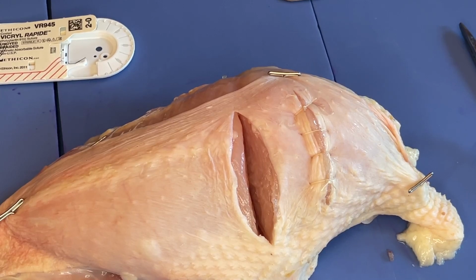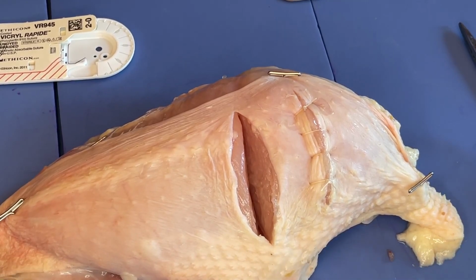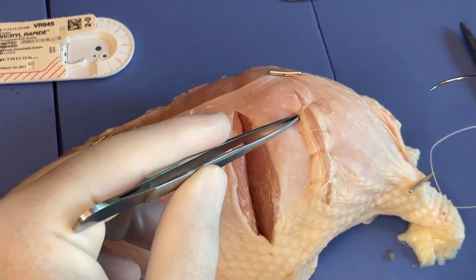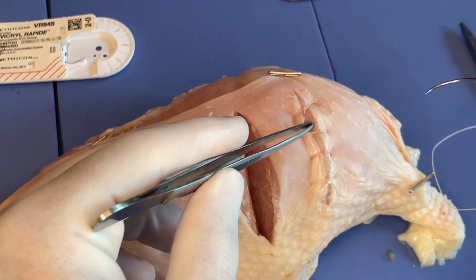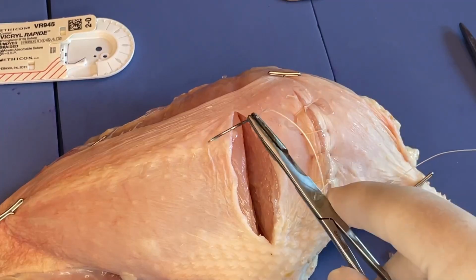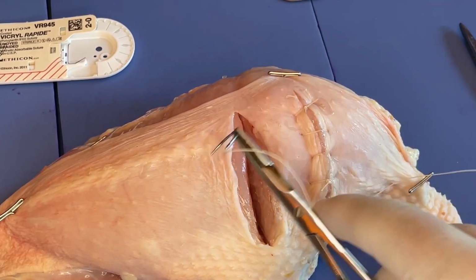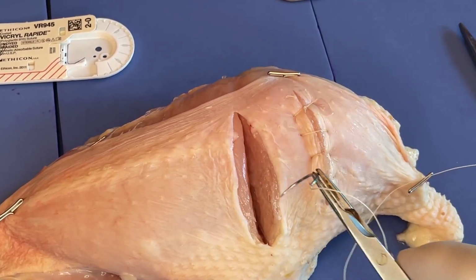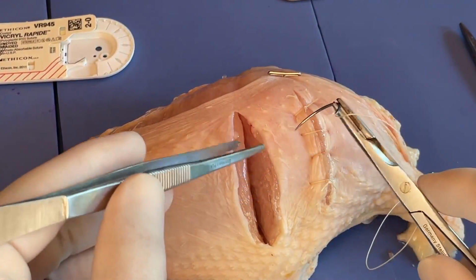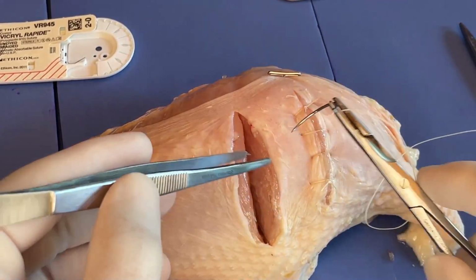All right, let's talk about running sutures, and you've got that same Vicryl. So instead of the interrupted, where we've got this space in between that's not being directly compressed by the suture, a running is a little bit more efficient way to close long openings, to get relatively even tensioning across, and to some degree a bit more hemostasis because the tissue is being a bit more compressed. But in a minute, we're going to take a look at a running interlocking suture that gets even better hemostasis.